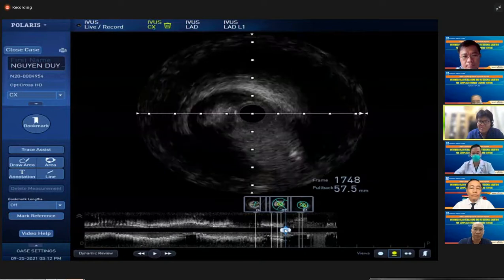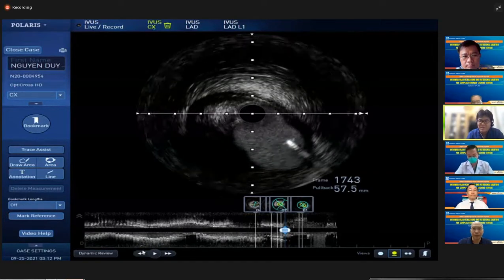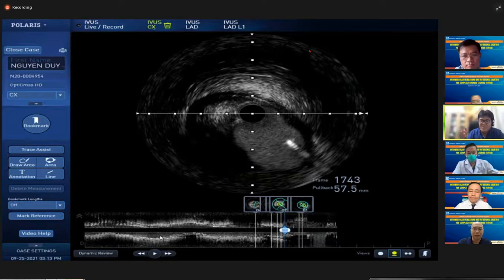In clinical practice, when treating the left main region, there is often a discrepancy between the proximal and distal reference diameter. Especially when treating the left main, we should always consider stent overexpansion capacity. That's why you should check the proximal and distal reference diameter. This is a key point to choose the optimal stent type.